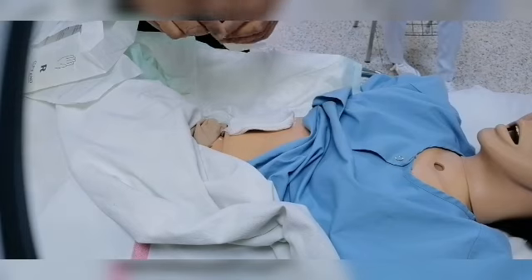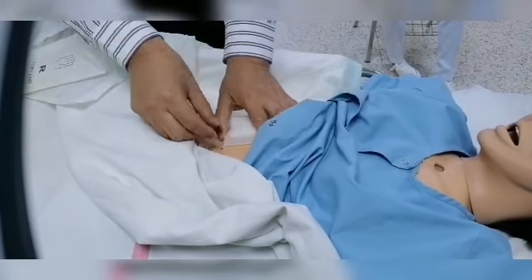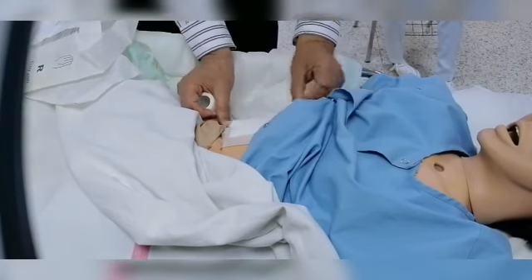So we cut the piece of plaster to suit the size of the dressing, and we will apply it.